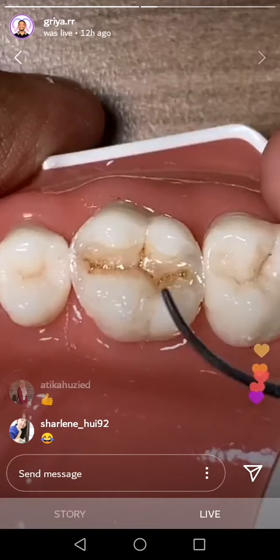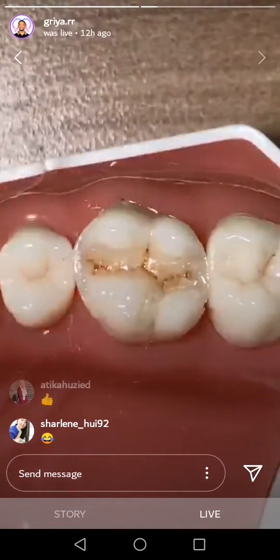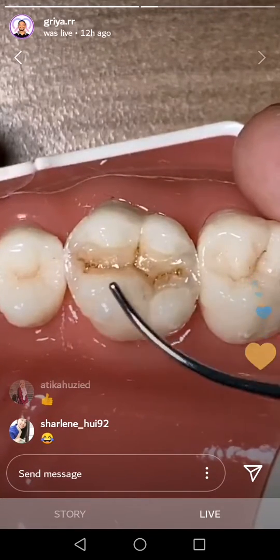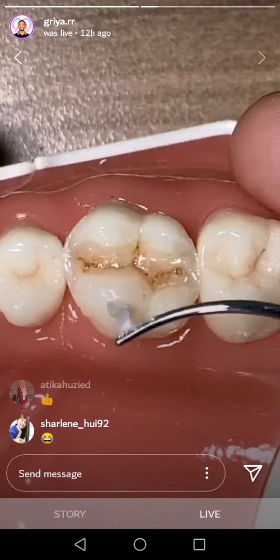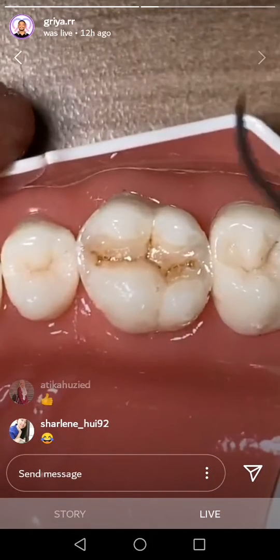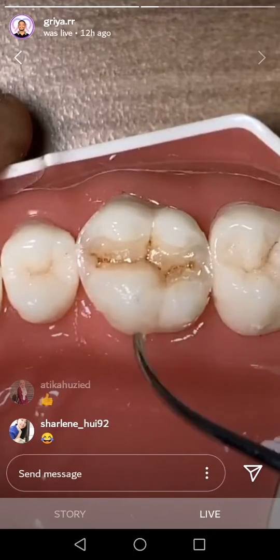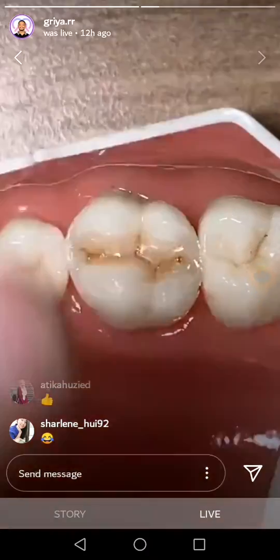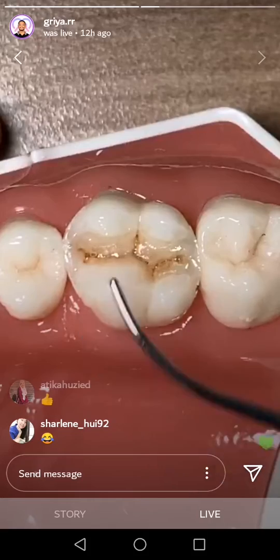I love excess. Why? Because with the excess, it means your composite is already homogeneous. See, I have a lot of excess. And then you can adjust again, and always do brushing. Brushing is very important.